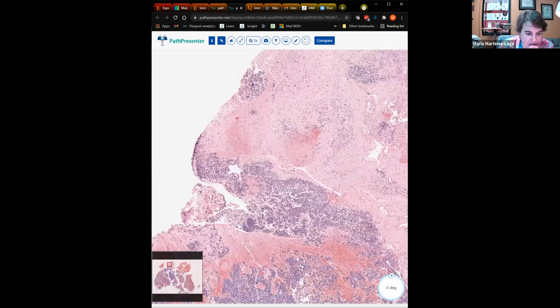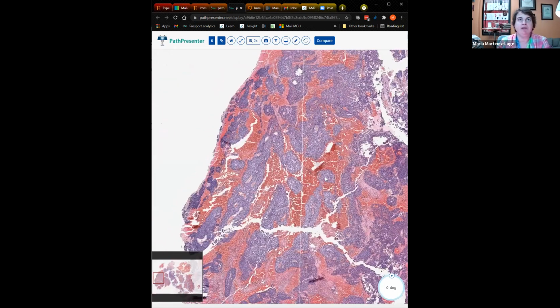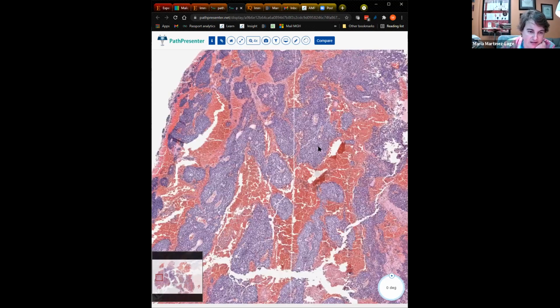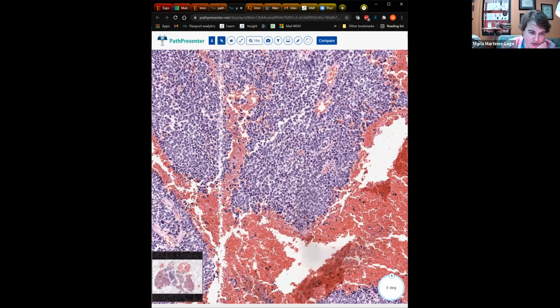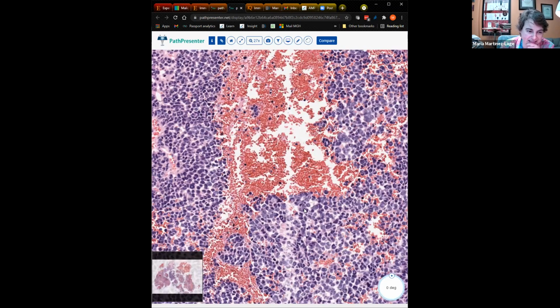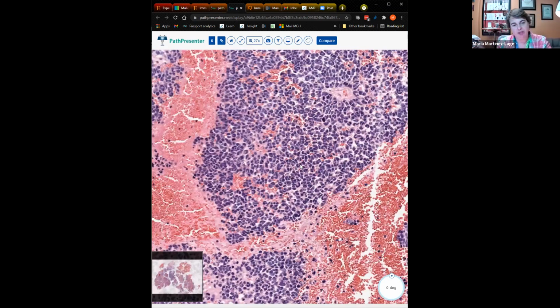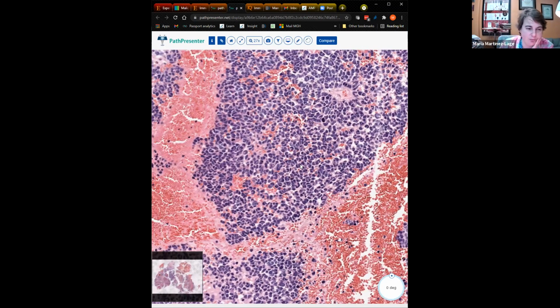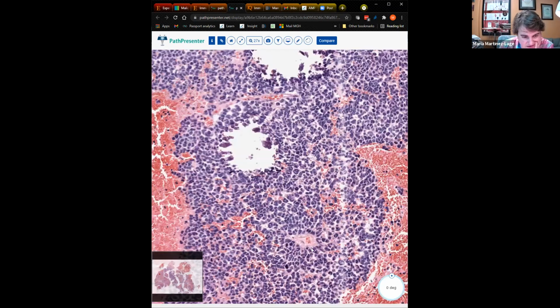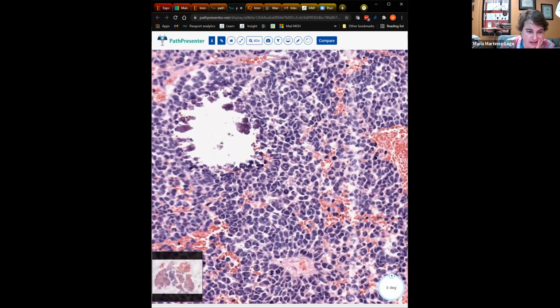Then there are pineocytomas, tumors that resemble the normal gland, and they're a little bit similar to neurocytomas in the sense that they're usually round, neurocyte-like tumor cells. They're bland, they're separated from one another. They don't have a lot of mitotic activity, no necrosis. And then there are tumors that are intermediate, called pineal tumors of intermediate differentiation, that are between a pineocytoma and a pineoblastoma. It's hard to get into those without having good examples to really look at.